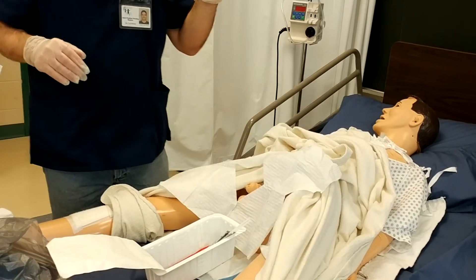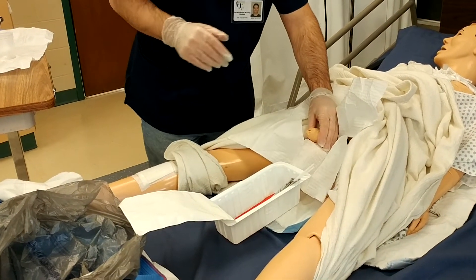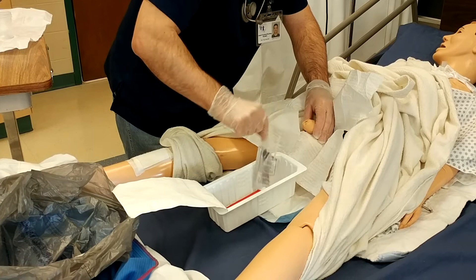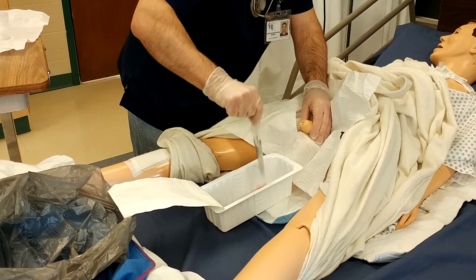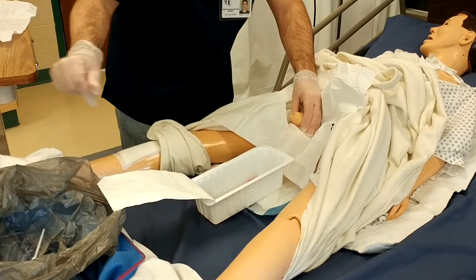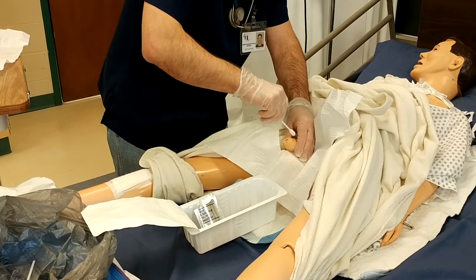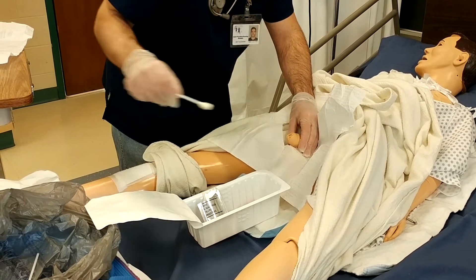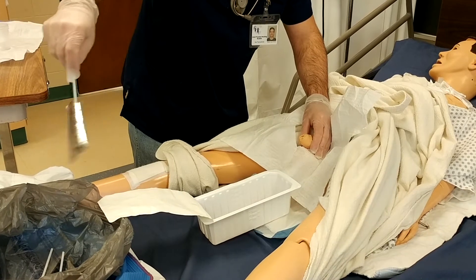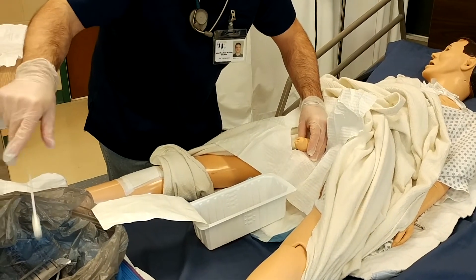Now this is going to be my contaminated hand, and this is my clean hand. So I'm going to pull back on the foreskin — it hasn't been circumcised. I'm going to pick up my swab here. Sometimes it could be a little bit of a pain. Moving around the meatus, toss that away. And I'll grab my second one — I'm going to go a little farther in, halfway in, down there on the glans. Then I'm going to grab my last one and go a little deeper, and toss it away.